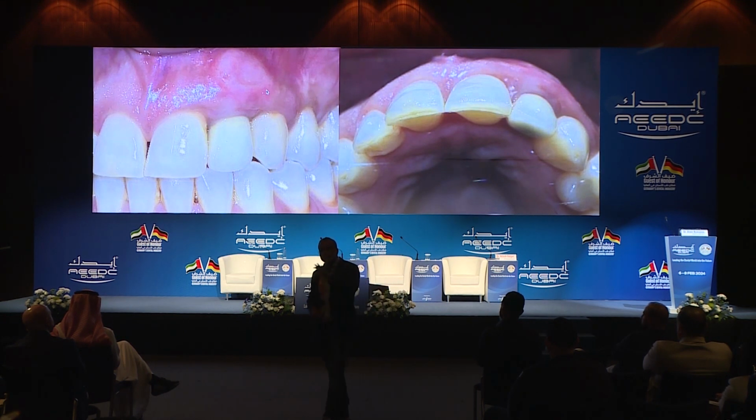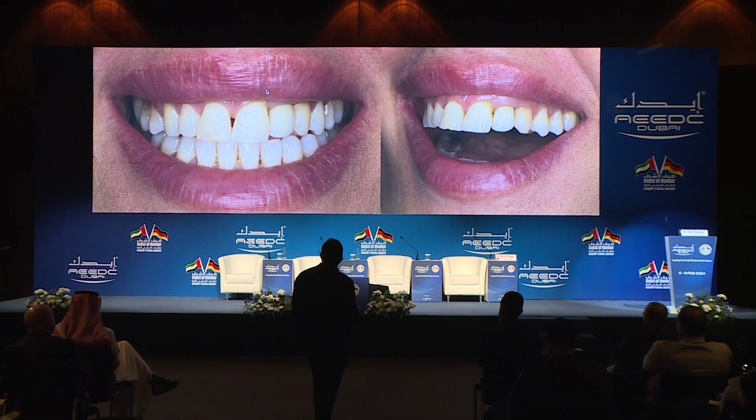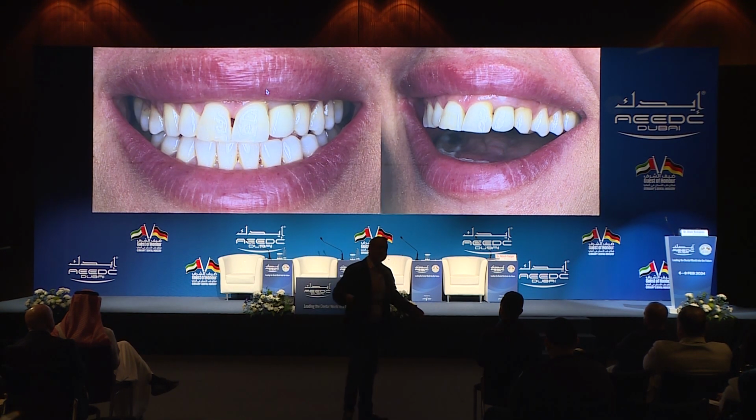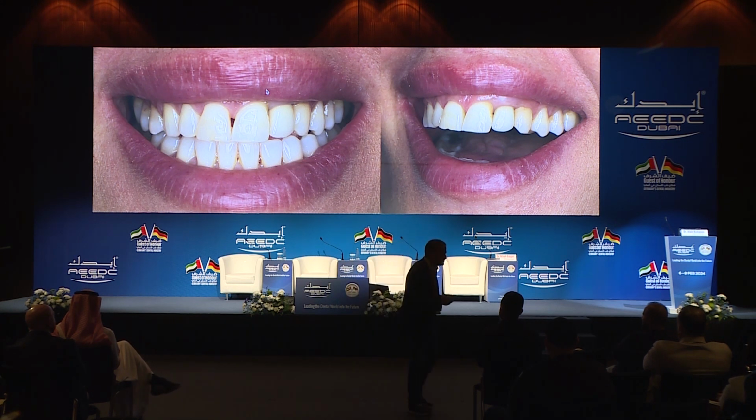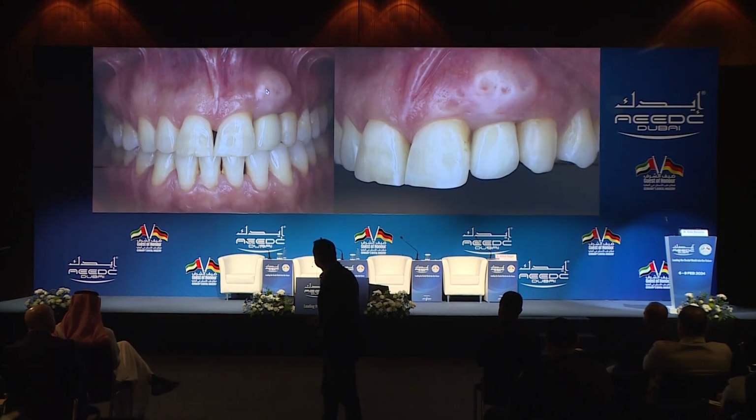Because you're removing the epithelium, what are you exposing under the epithelium? You're exposing the free gingival graft, which is a very collagenic graft. And then she left the country again, came back a few months ago, in December. I said, please, can you come for a picture? I'm coming to Dubai. I want to show my friends here at the Ritter Forum what happened to this graft after 10 years. She came for the 10 years follow-up. I wanted to see, because I didn't see her. She moved to Saudi Arabia. And 10 years post-op, this is what happened.